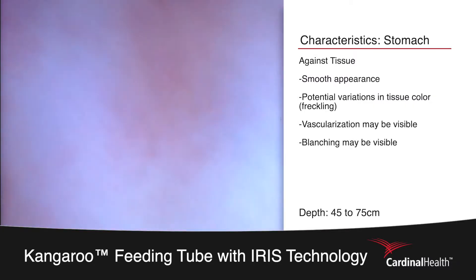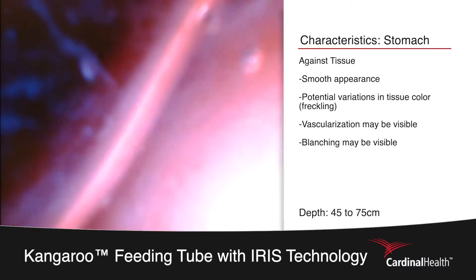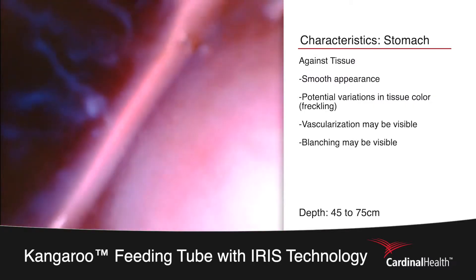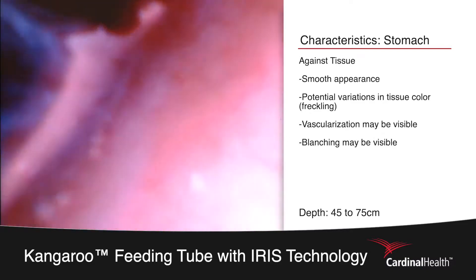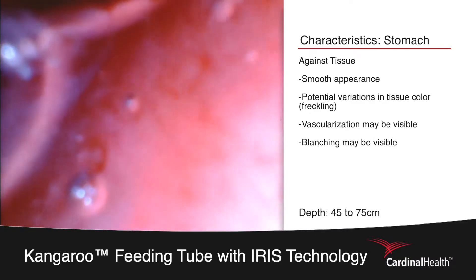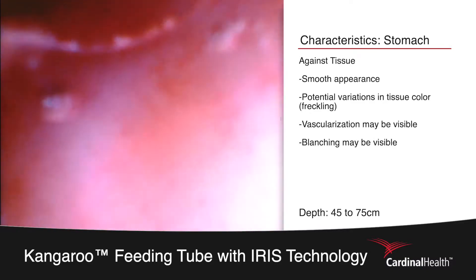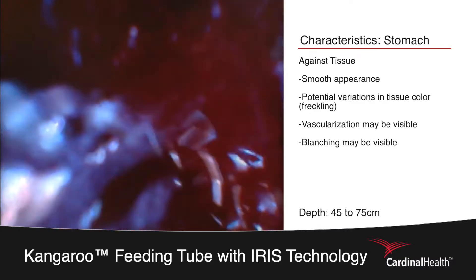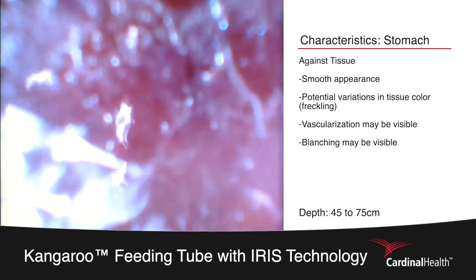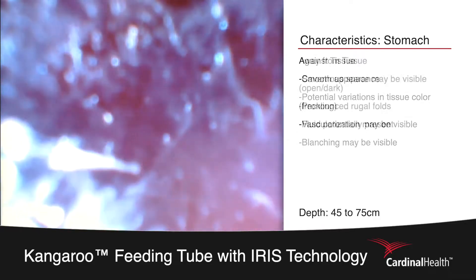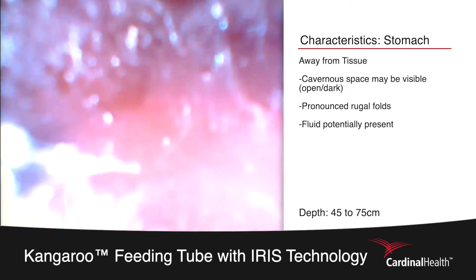Internal anatomy varies in every patient. With this patient, the placer makes multiple attempts at entering into the small bowel, as can be seen by progression and then retraction back towards the top of the stomach.